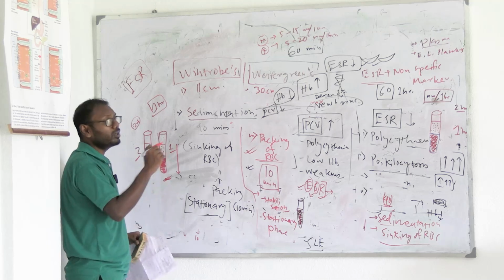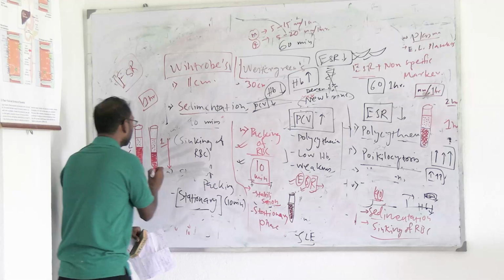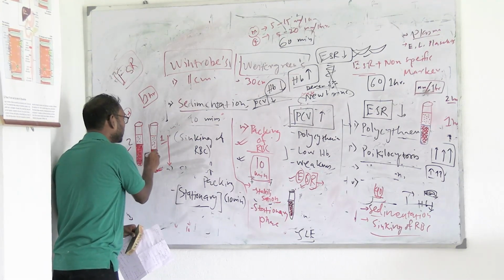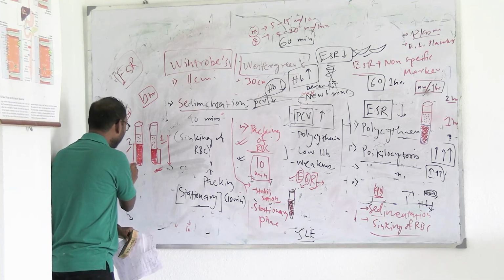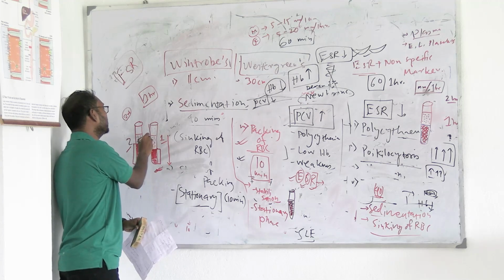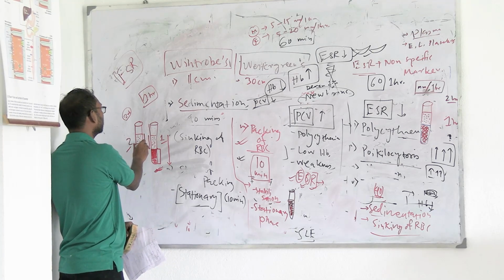This is understood. Now how do we measure? We have to calculate, and we write those in millimeters per hour. So we will be calculating the millimeters. How? Where does packed cell volume come in here? These are your packed cells, a term I keep using. So your packed cell volume is this. Understood? And erythrocyte sedimentation rate is measured from above. Look, in this case, even if the blood volume is the same, the sedimentation is till there, and in this test tube the sedimentation is till there.